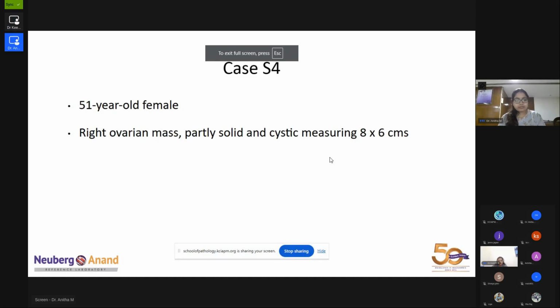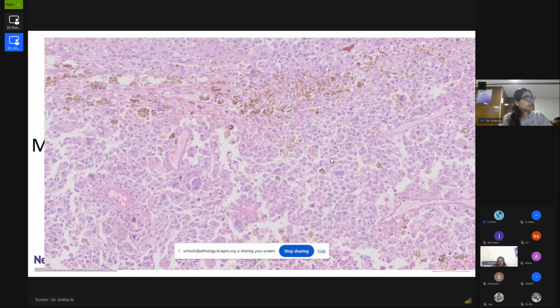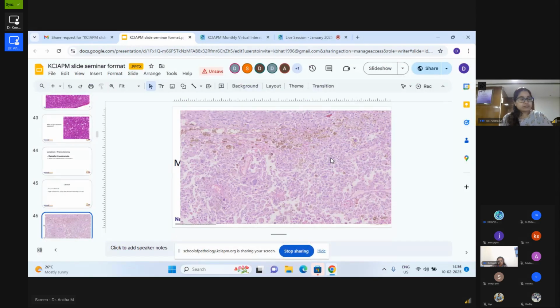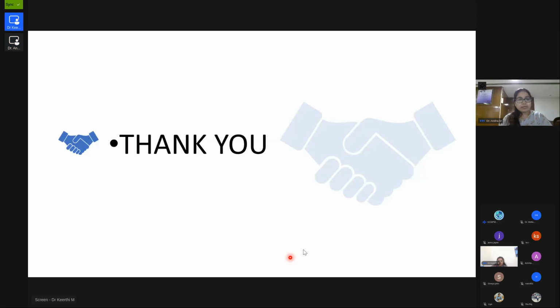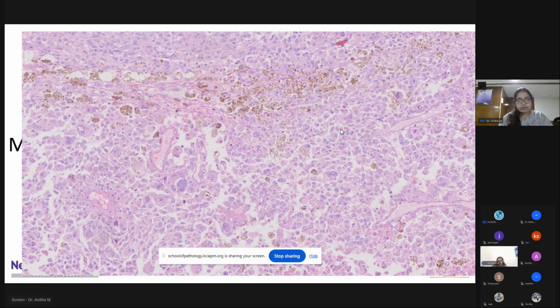Okay, Dr. Keith. So, 51 years female with ovarian mass, solid and cystic lesion. As you had described, these are Dr. Kirti, epithelioid. Request you to stop sharing your screen once. Yes. So, yes. Please go ahead.